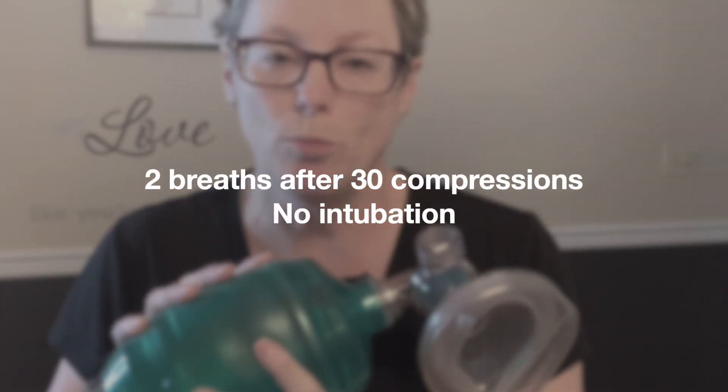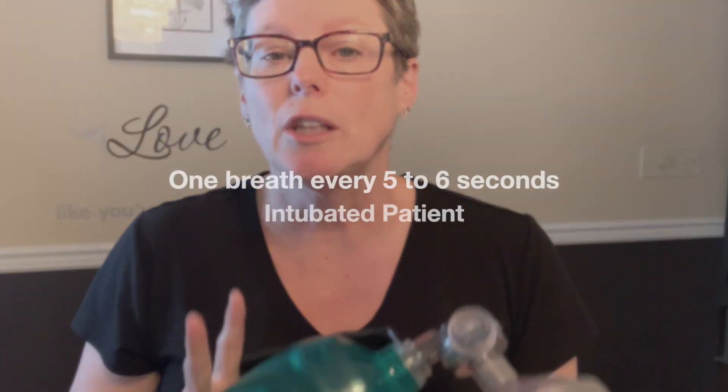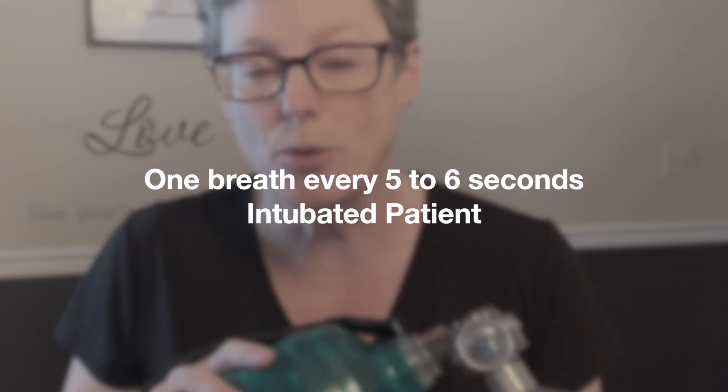When it comes to how many breaths to give during CPR: if you are assisting with compressions and your role is ventilation, you give two breaths after every 30 compressions for a non-intubated patient. If the patient is intubated, give one breath every five to six seconds during compressions, and try to coordinate on the upstroke as the chest is rising.